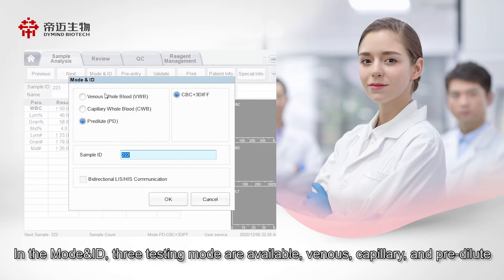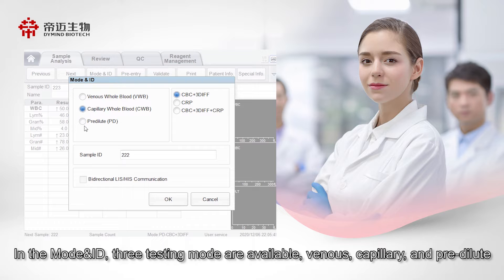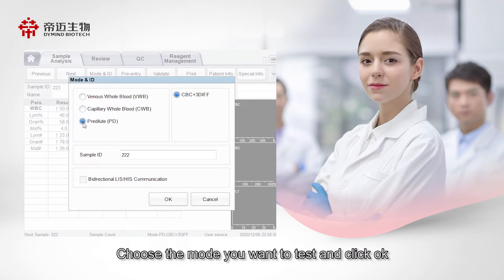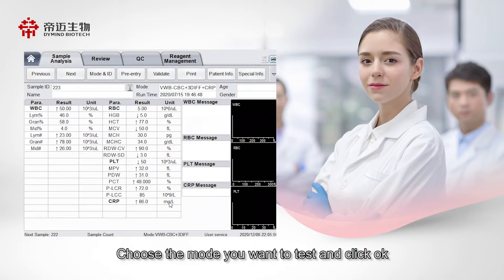In the Mode and ID section, three testing modes are available: Venus, Capillary, and Predilute. Choose the mode you want to test and click OK.